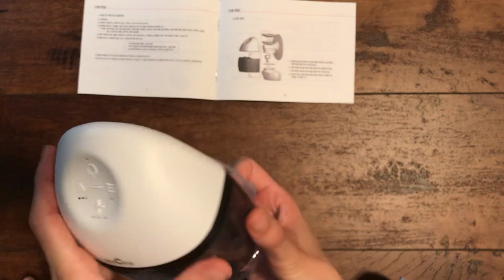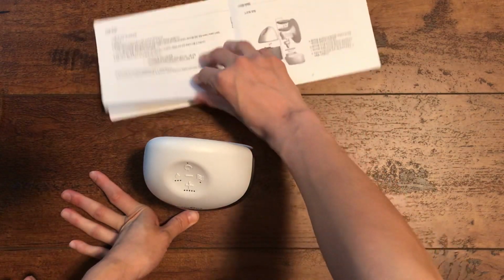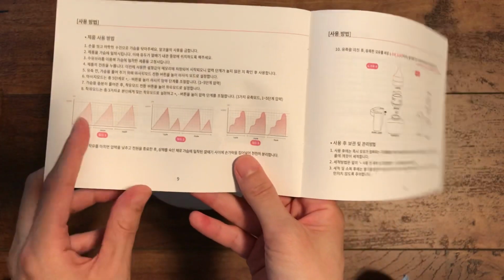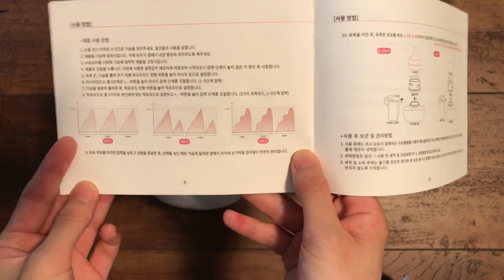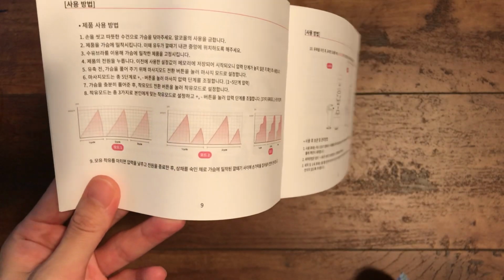I honestly don't know if anyone will use the third mode. It sounds a little bit strange to me, but I guess it depends on your preference. And again, this manual goes over what those modes will look like on a graph. I personally just use the first mode because I think that's what's most consistent with my baby sucking. So it really depends on your preference.